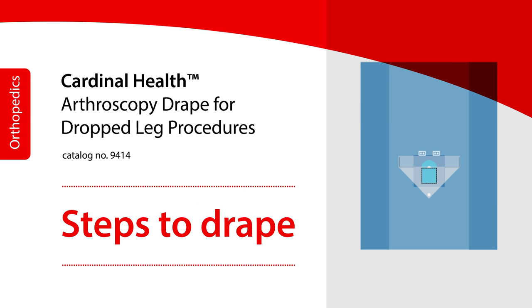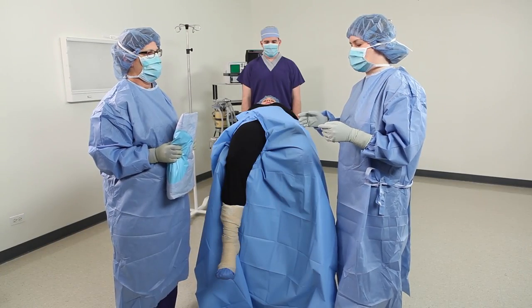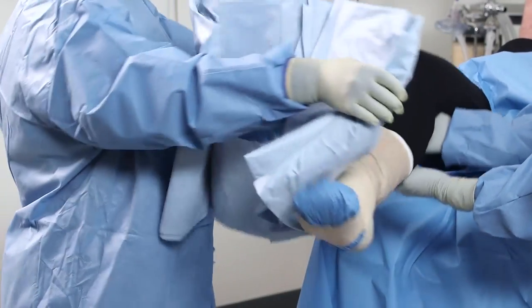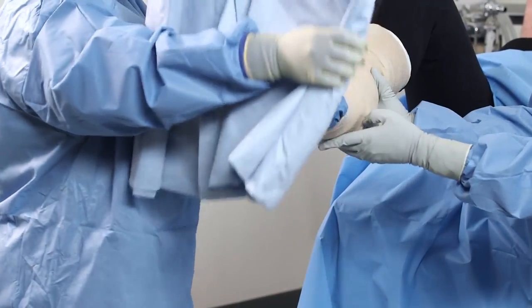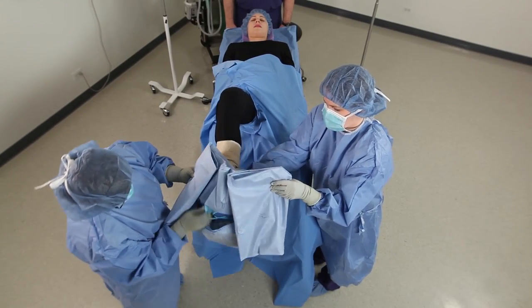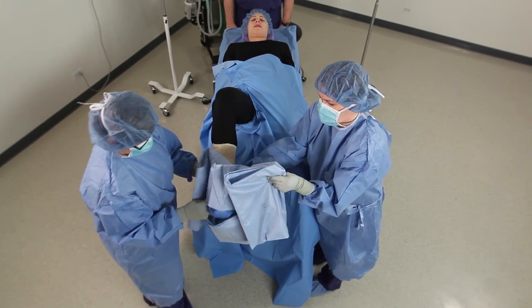Before applying the arthroscopy drape, ensure a U-drape, stockinette, and cohesive bandage are already in place, then follow the orientation markings on the arthroscopy drape. Grasp the patient's leg and pull drape onto extremity to just above the knee.